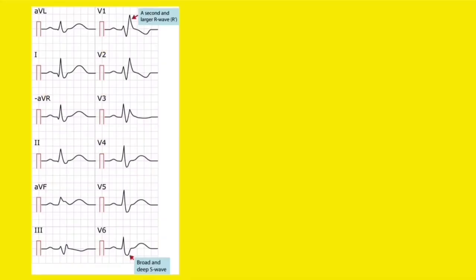Looking at this ECG, we can see in V1 there is an RSR' pattern, and in V6 we can see an RS pattern with a deep, broad, and slurred S wave in V5, V6, and lead I AVL. This is the characteristic ECG of right bundle branch block: in lead V1 we get the RSR' pattern, and in leads AVL, V5, and V6 we get a broad, deep, and slurred S wave.